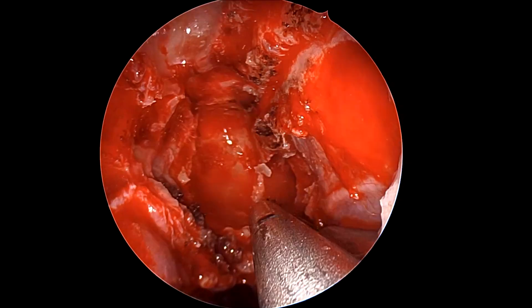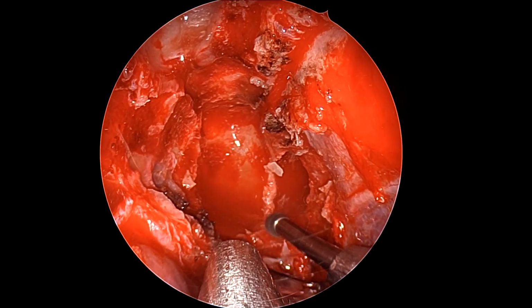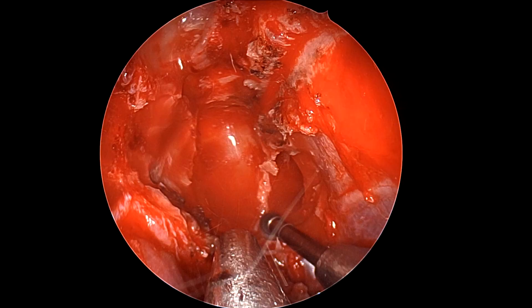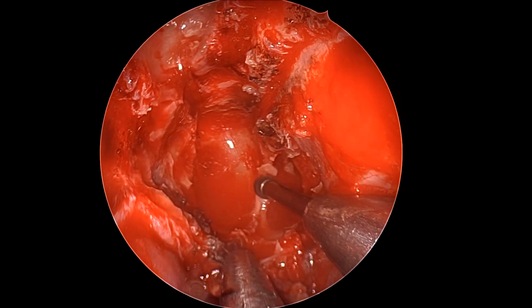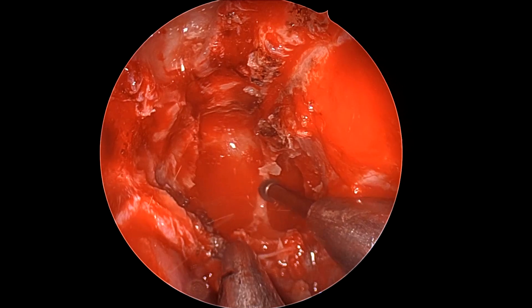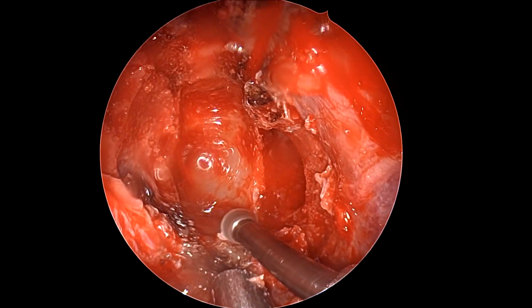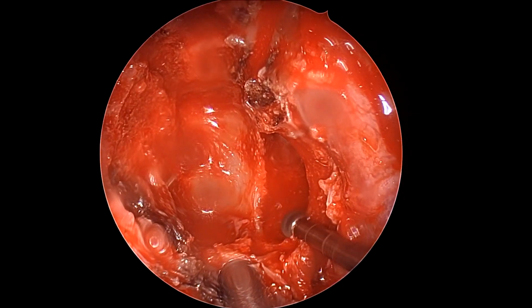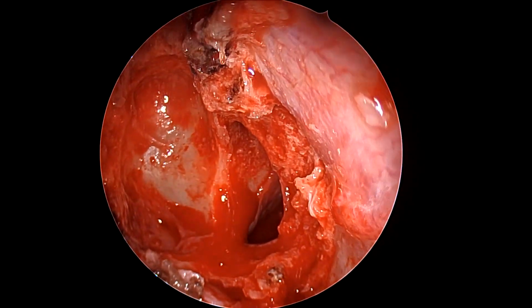The starting part of the drilling can be done using a cutting burr. I don't think anything is wrong with the cutting burr in the front part of the drilling as long as the control on the drill is good, which means the central part of the intersphenoid septum, the base of the rostrum or sphenoid. In fact, a little bit inferiorly as well is all okay with the cutting burr. And once we come to the actual drilling onto the sella itself, or when we go superior and laterally, probably then that would be a good time to switch to a coarse diamond or a diamond burr and not use a cutting burr.